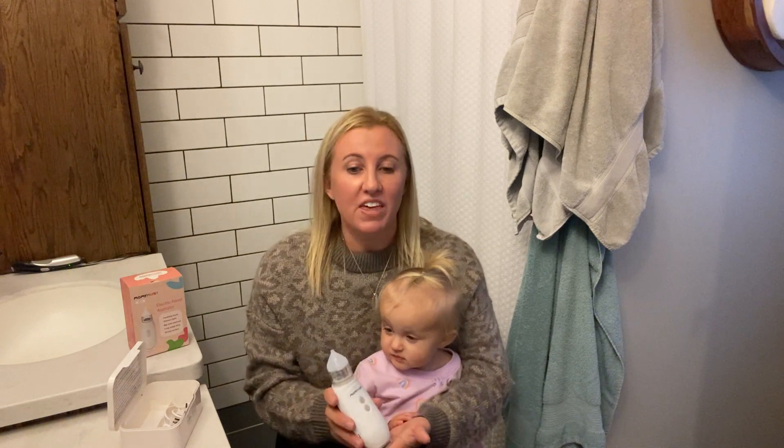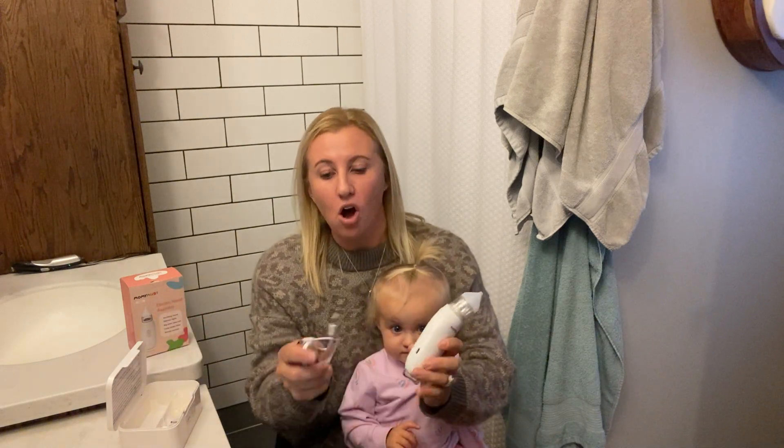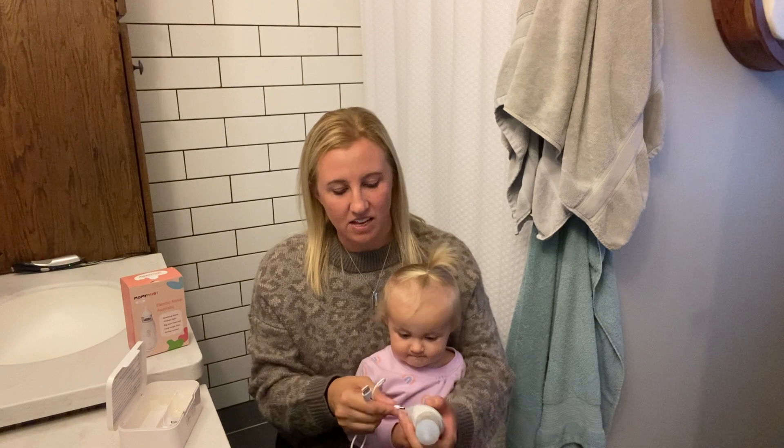Also, this has a rechargeable port right on the side here. Simply stick it into the wall — everybody has a USB port, so plug it in on the side. It has 120 minutes of chargeable use, so you won't have to be charging this thing that often, because hopefully you won't be having to use it a lot.